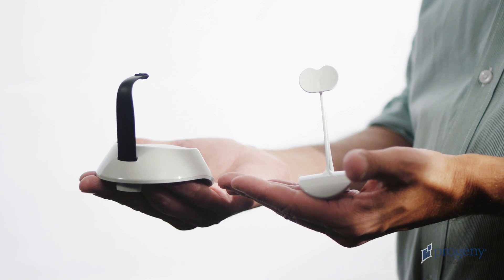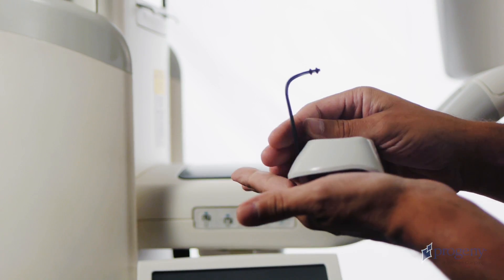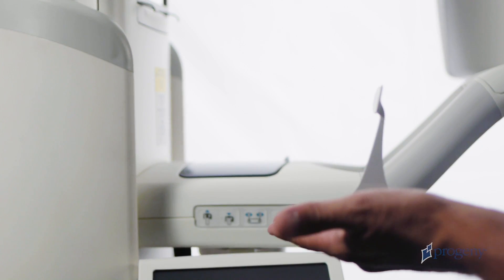The patient positioners and sanitary bite pieces are stored in a compartment on the positioning table. There are two different types of positioners: a bite piece and chin rest for panoramic exams, and a TMJ positioner.